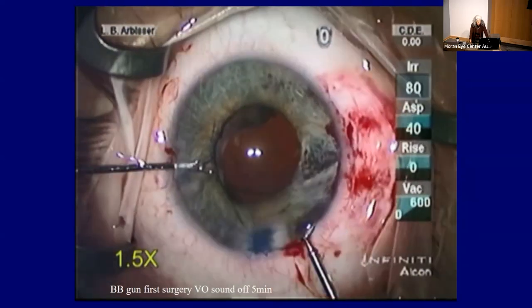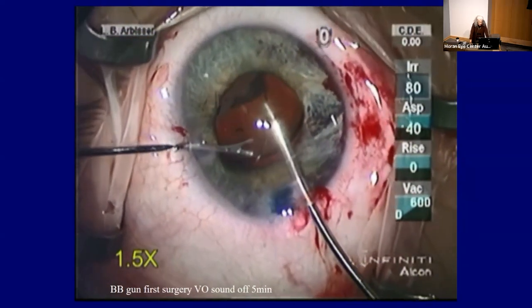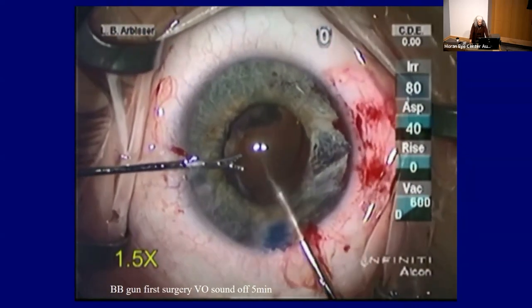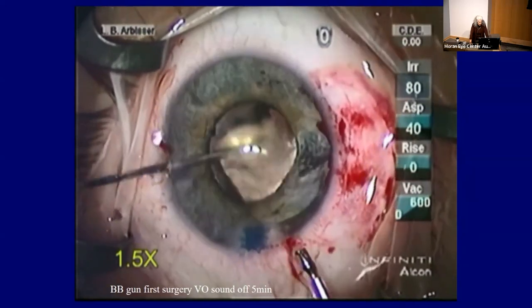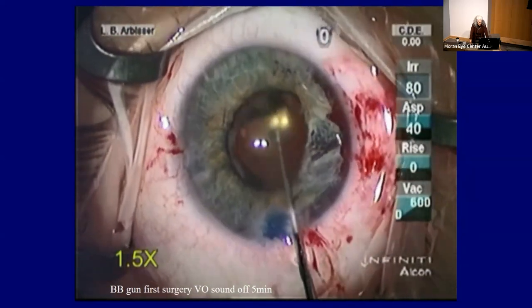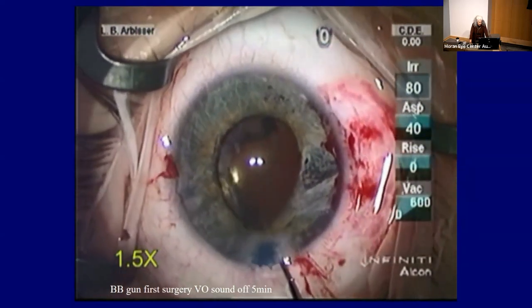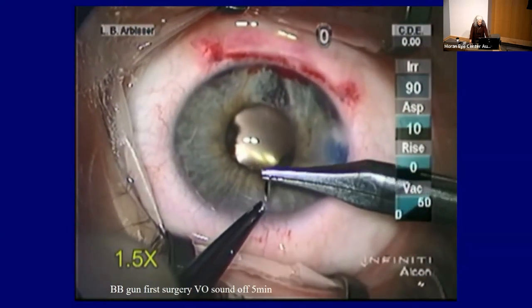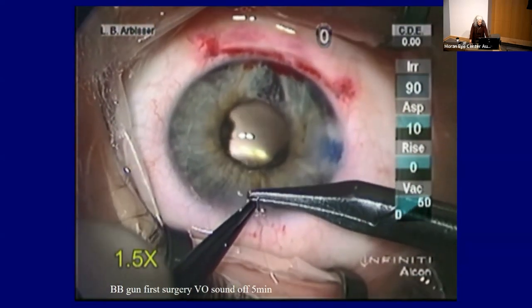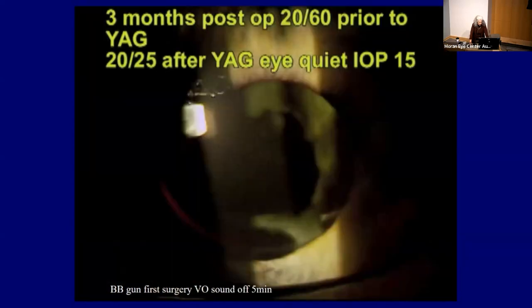I decided that I have enough anterior capsule that I'm going to put in a three-piece lens. I didn't think a one-piece lens would be okay because I couldn't see any capsule for over 180 degrees, so I wouldn't allow the one-piece haptic to be in the sulcus or near the iris. But I decided that I had enough coverage to place the three-piece IOL, which I did. I looked everywhere for any possibility of any vitreous and didn't see any. There's my last dilute Triessence.